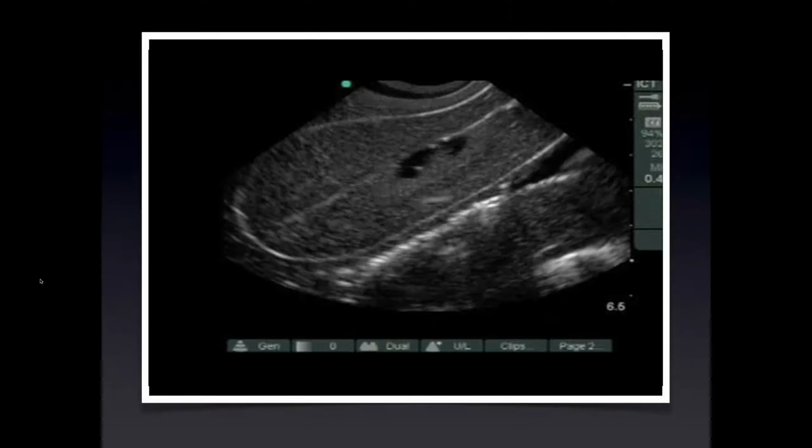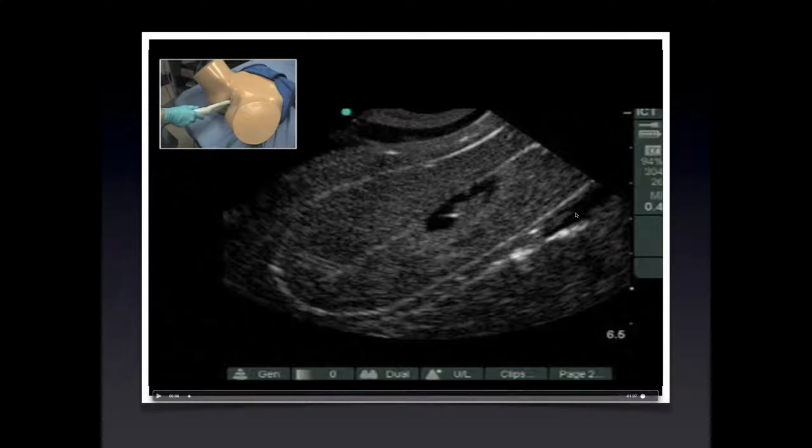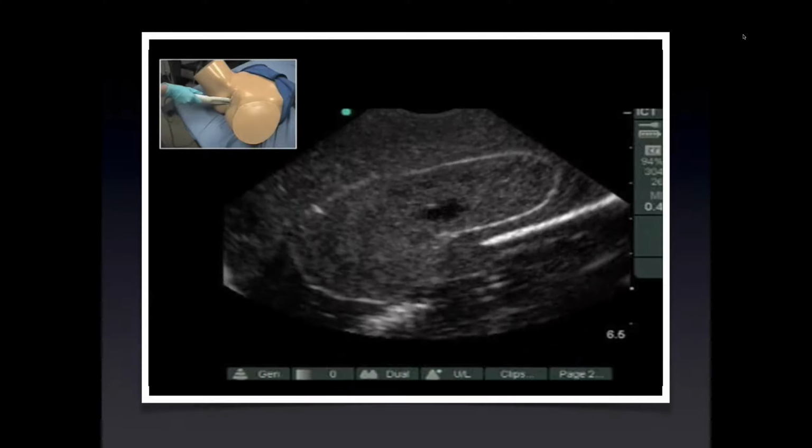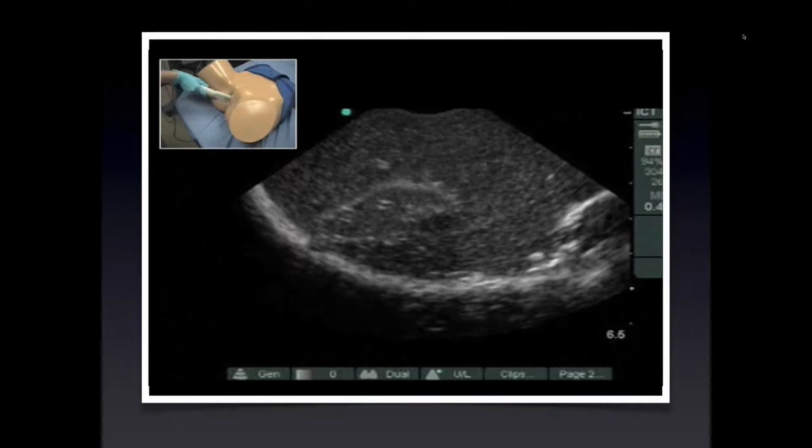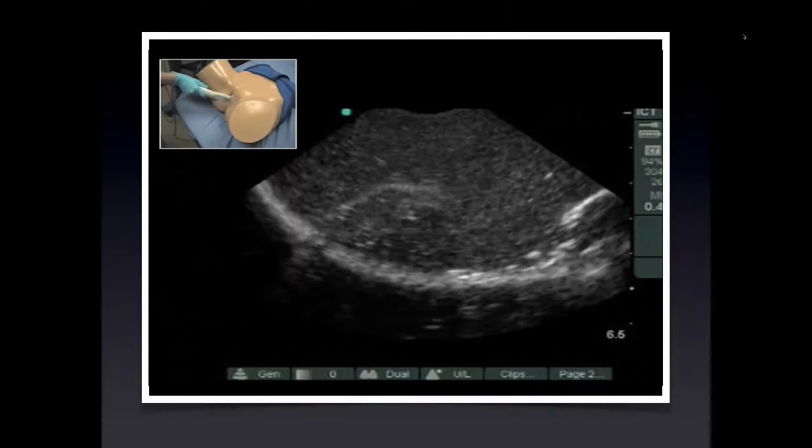After having evaluated endometrial contents, you should look outside the uterus. First, look in the posterior cul-de-sac as well as the anterior cul-de-sac for free fluid. After that is complete, we're going to go ahead and evaluate the adnexa, sweep out into the adnexa and through the ovaries, looking especially for heterogeneous masses and tubal rings around the ovaries. Again, more on these types of pathologies later.